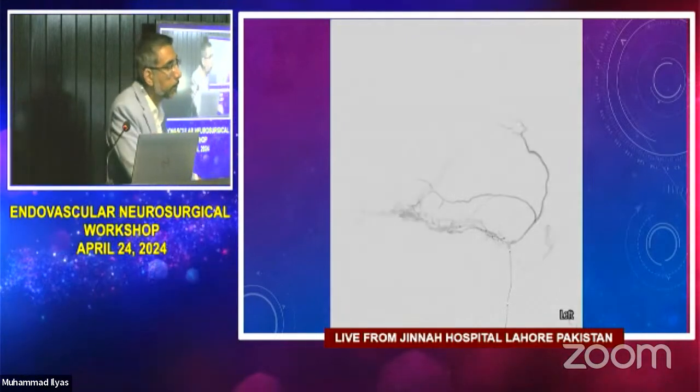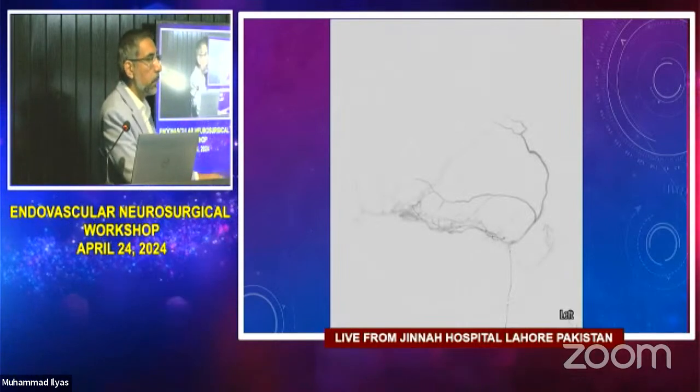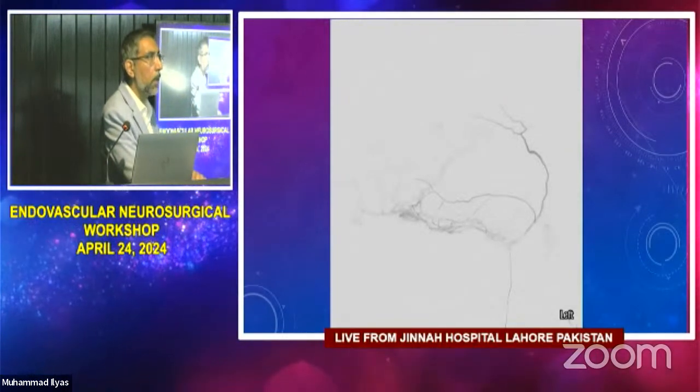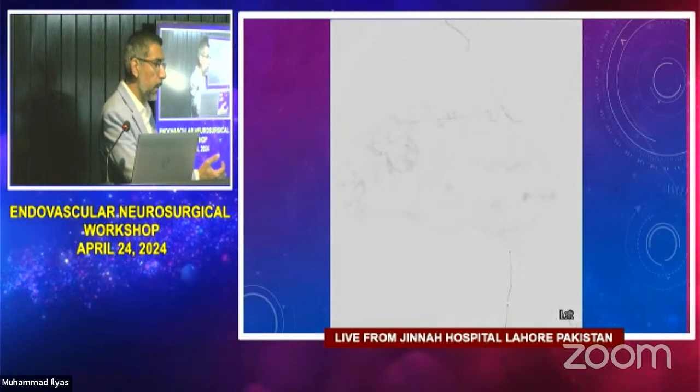What viscosity was it, 18 or 50? No, usually, so Onyx is 18 and 34. This was 18 because 18 has better chances of penetrating into the fistula. Yeah. But now there's a lot more liquid embolic. So you have Onyx, which is 18 and 34. You have Phil. You have the glue.